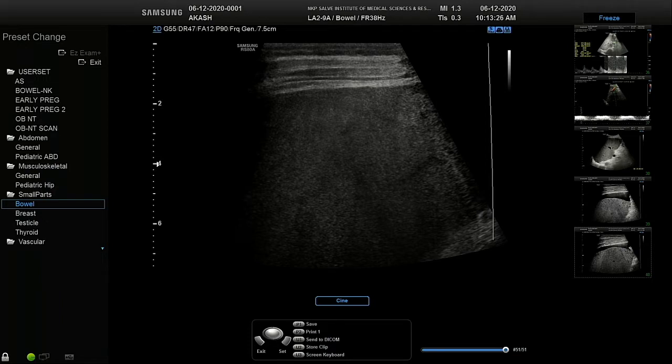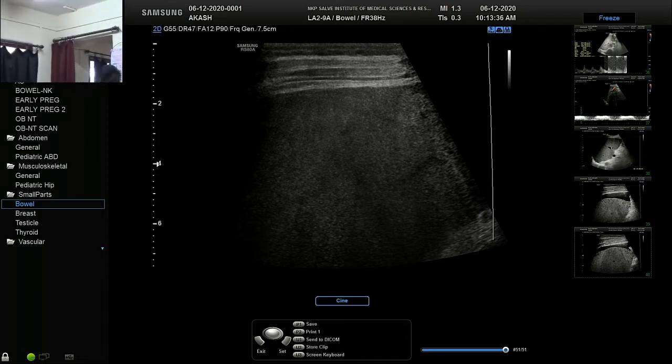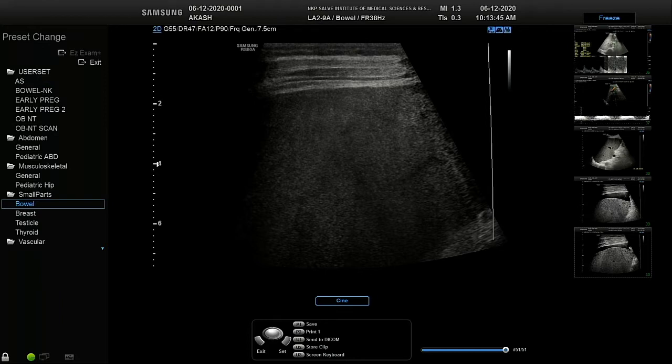Female patient again, she had a history of hematemesis. And what is the presenting complaint? Fever on and off, decreased appetite, melena she has. So we have indicators that patient has a portal hypertension.